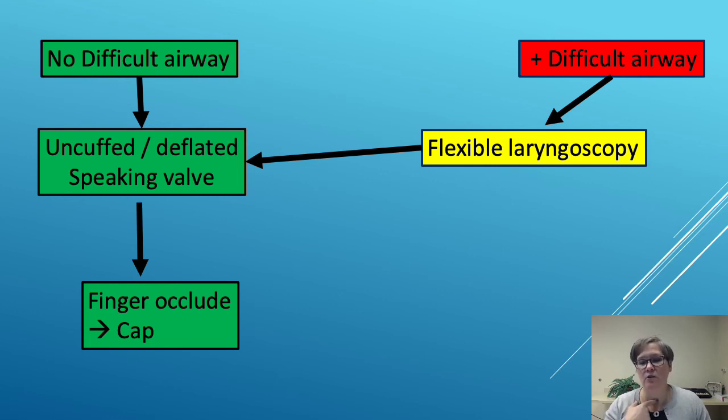So in those cases, we'll put the cap, we'll kind of hang out, assess the patient, check the oxygen level, chit chat with the nurse, but always keeping an eye on the patient to make sure that they perceptually and number-wise are looking good. Even before a capping trial, we're always in communication with the nursing staff and the respiratory team, so everyone's on the same page and knows what's going on. So if that capping trial goes well, it's usually stayed on for like a day or two, again, depending upon your sense of confidence that decannulation is going to be successful.